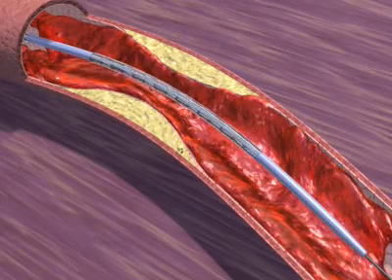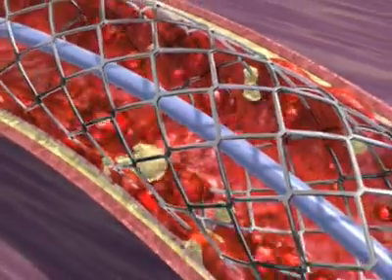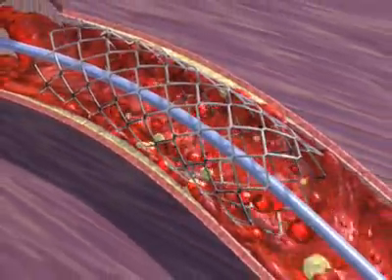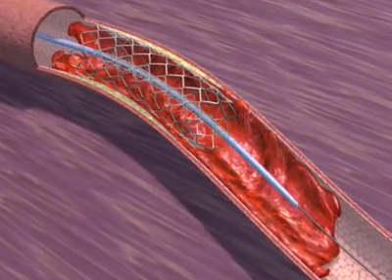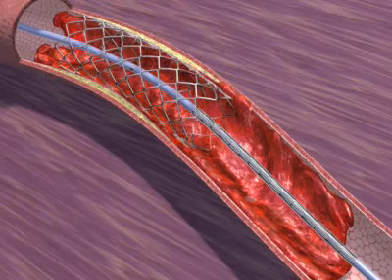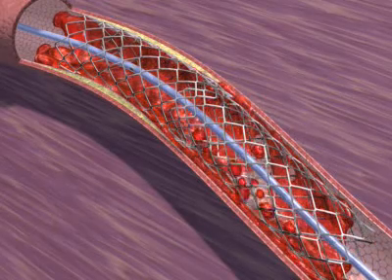Stent placement compresses the residual clot under the stent struts and causes a cheese grater effect. This results in an additional thrombotic embolization. Due to the apparent long length of the lesion, a second stent is placed. Placement of this stent also causes some distal embolization.